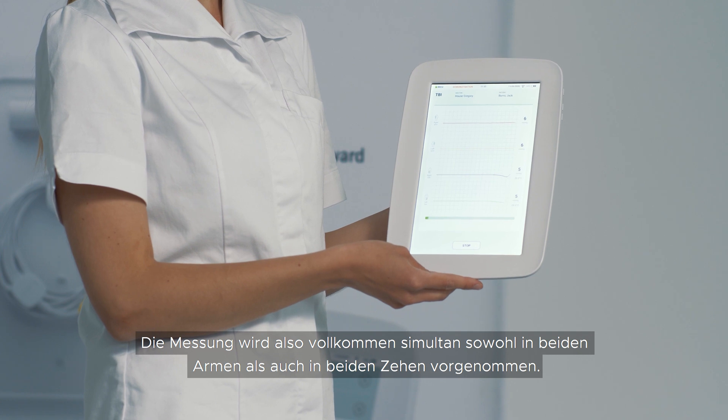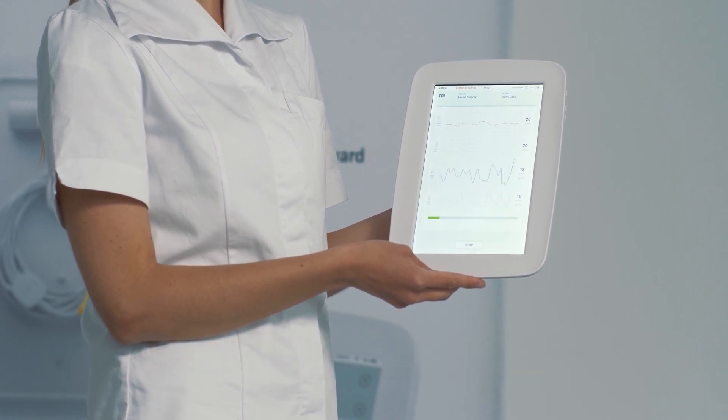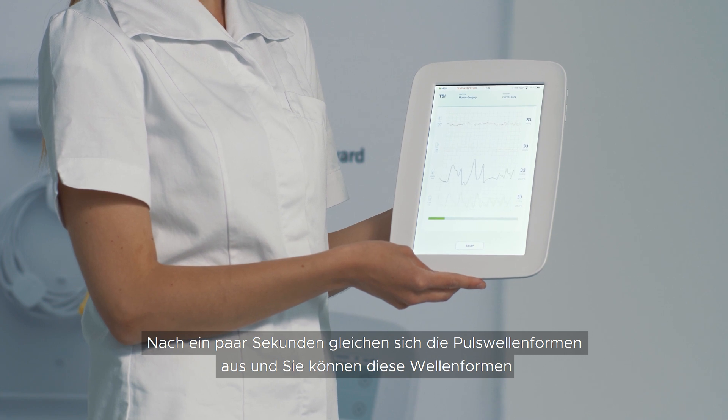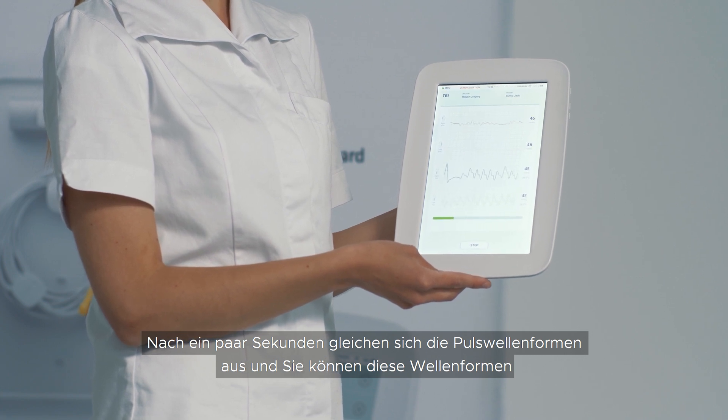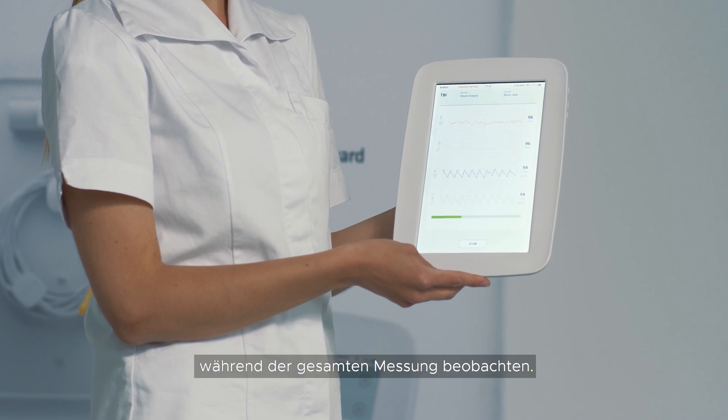The measurement is completely simultaneous in both arms and in both toes. After a couple of seconds the pulse waveforms level out and you can monitor the pulse waveforms for the entire measurement.